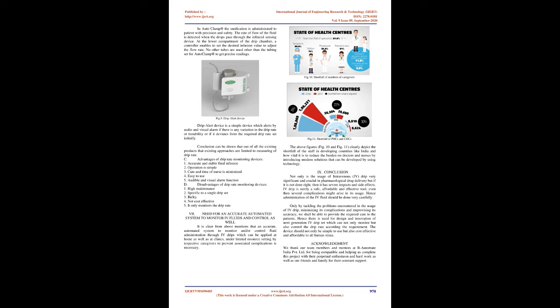Another drip monitor based on an optical sensor called AccuFlow was commercialized, and the results of its evaluation were reported by Shrofa et al. The device displays the flow rate and has alarms which operate when the rate deviates from the preset value. Other companies like Shift Labs tried to develop a compact drip monitor, Drip Assist, which was also based on optical sensing. Vinali et al. reported on the design of a stand where an alarm for low fluid level is also proposed.